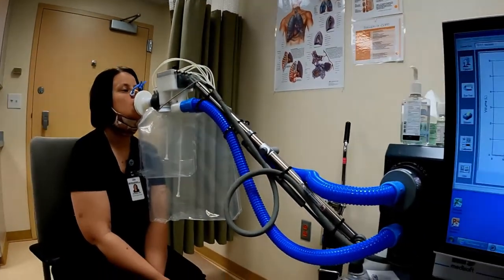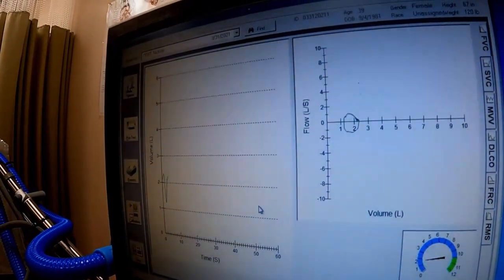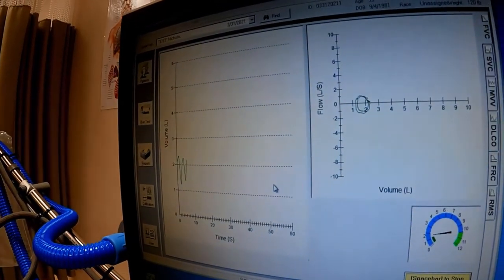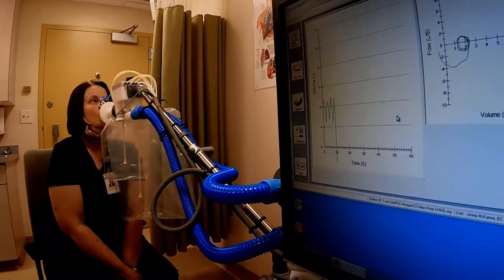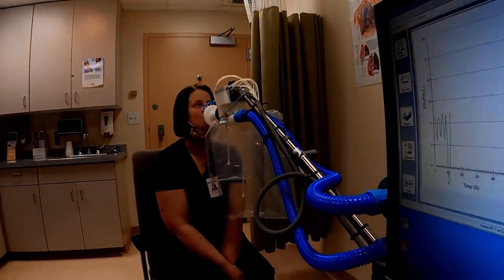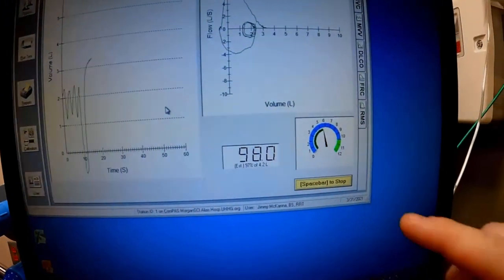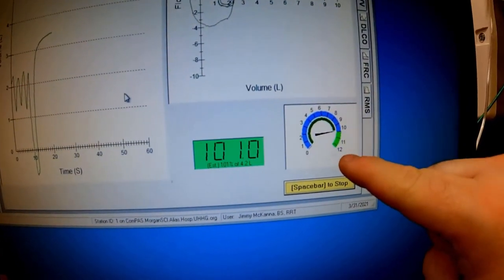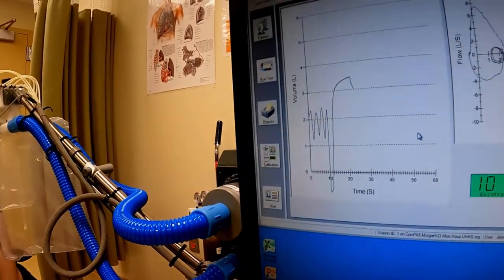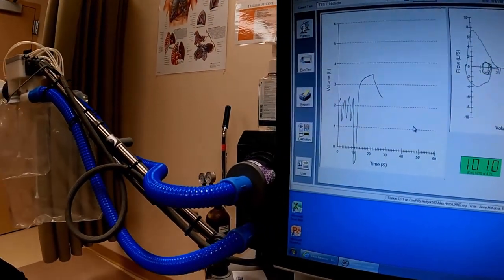Nose clips on, everything's good. So she's breathing normal. All right. Whenever you're ready, I want you to take a big deep breath in and blast it out. Big. Now blast. Keep pushing, keep pushing, keep pushing. 3, 2, 1. Big breath in. Good job. Good job. It's so long.